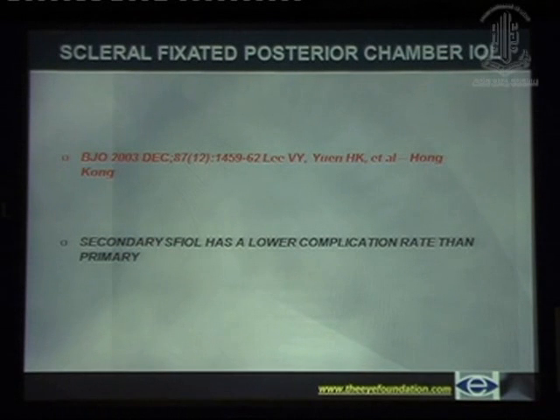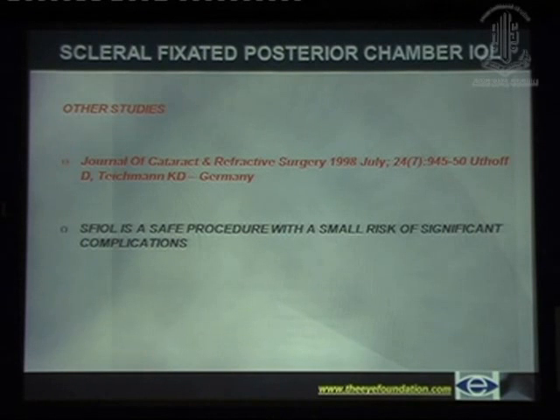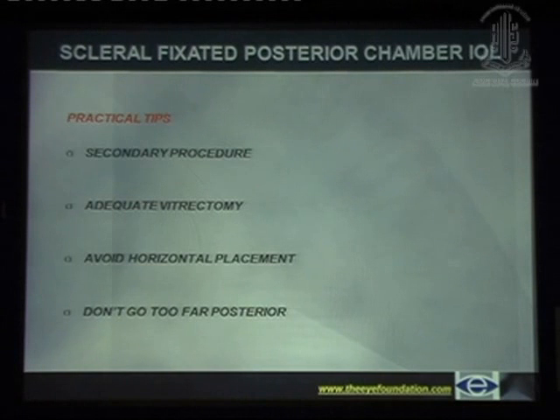If possible, do it as a secondary procedure, possibly after 6 weeks of the primary procedure. This can reduce the incidence of complications like CME or RD, and do adequate vitrectomy before putting in this scleral fixated IOL.